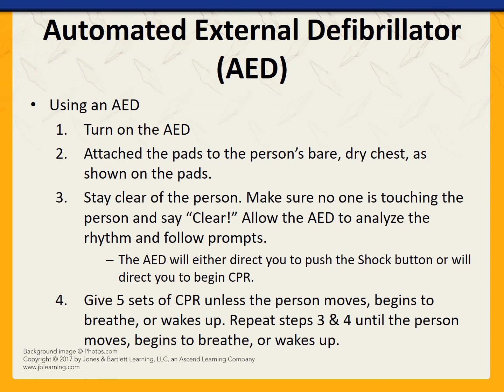The AED will either direct you to push the shock button or will direct you to begin CPR. When prompted to begin CPR, give 5 sets of CPR unless the person begins moving, begins to breathe, or wakes up. Repeat steps 3 and 4 until the person moves, begins to breathe, or wakes up. If they do begin to move, breathe, or wake up, do not allow them to get up. Have them stay down and roll them into recovery position and keep them in recovery position until EMS arrives.